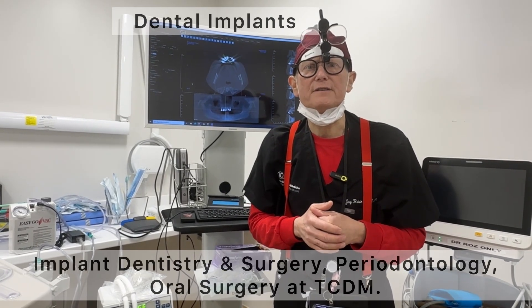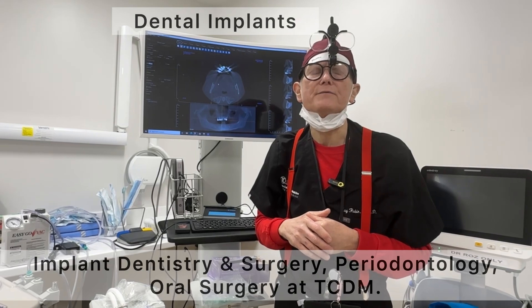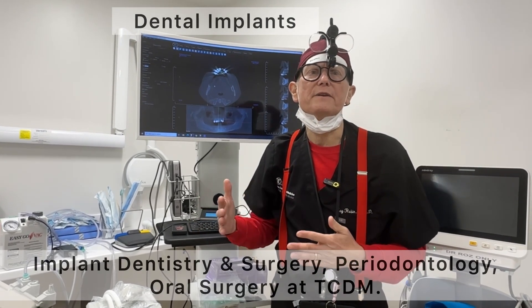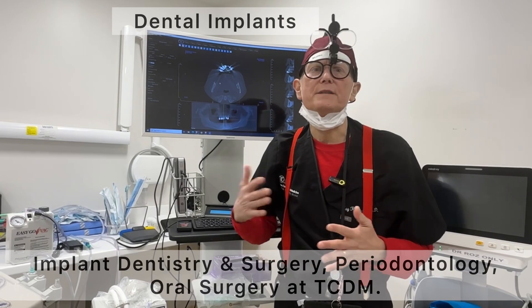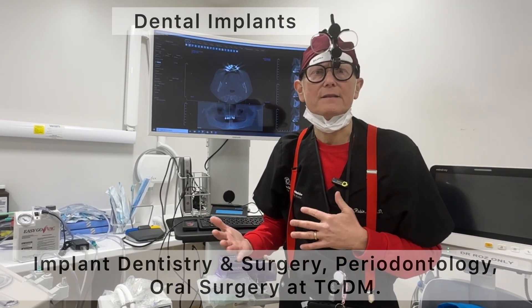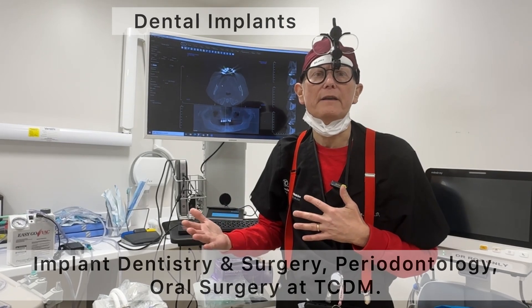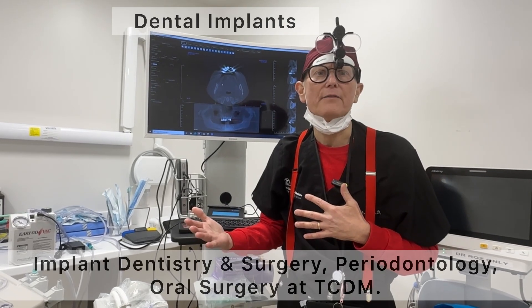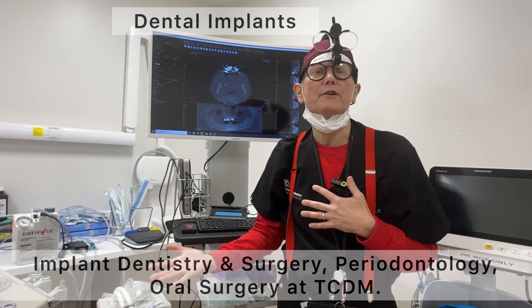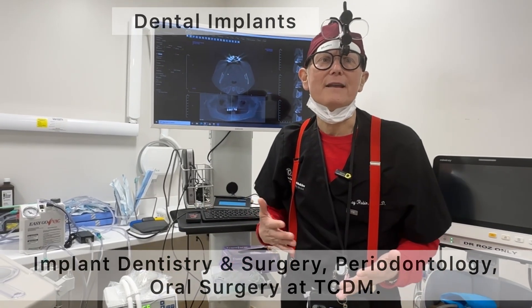It's digitally designed — it's a game changer — because we're able to design where the placement of implants are, where the placements of the teeth are, and how the final prosthesis will look even before we've done anything in the patient's mouth. We've been able to show patients what they're going to look like when they're done with the surgery and the prosthetic.